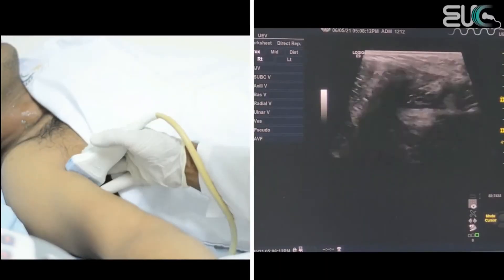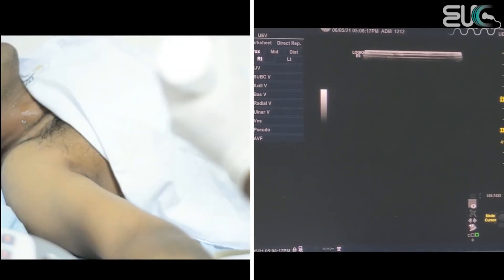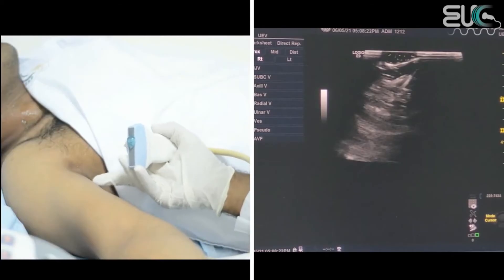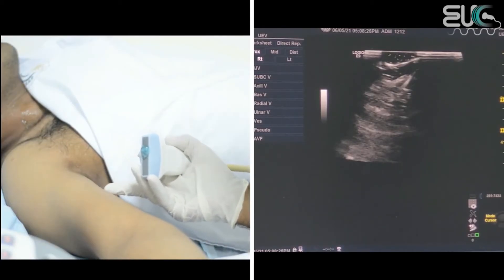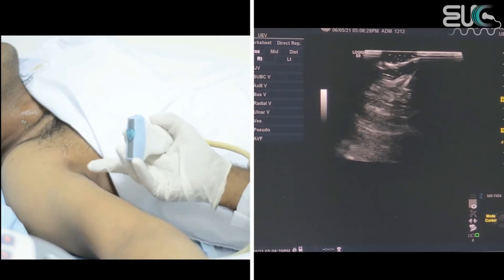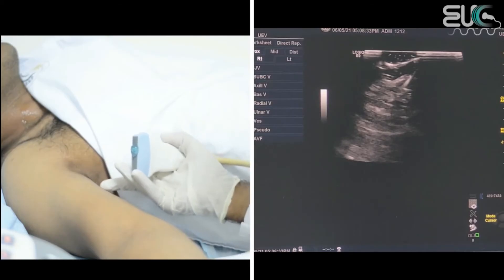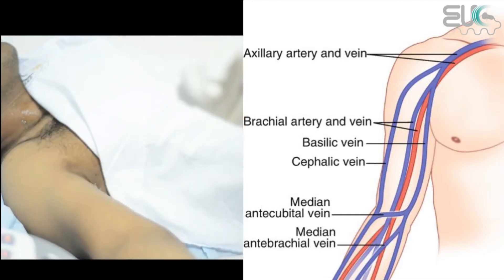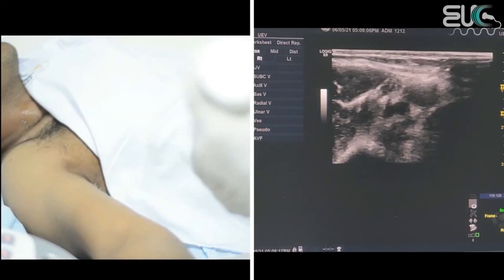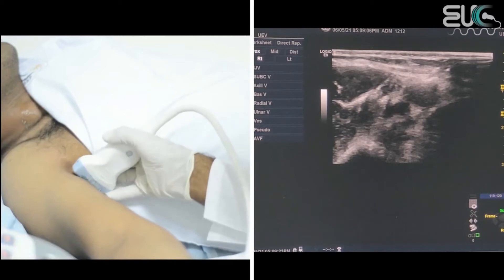At the arm, we have two types of veins to check. We have the brachial vein, which accompanies the brachial artery, and we also have two superficial veins — the medial one is the basilic vein and the lateral one is the cephalic vein. I will use the highest frequency probe we have, the 15 MHz, to get the best image.